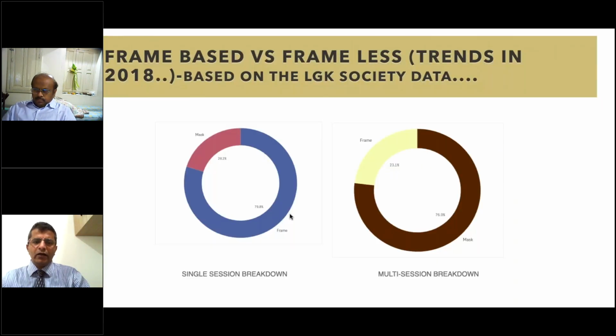Now we look into the new trends in gamma knife treatment. This is the information I received from the Leksell Gamma Knife Society for the year 2018. It shows that for single session treatments, in the majority of cases, frame-based radiosurgery techniques are used, and the multi-session treatments are using a mask.